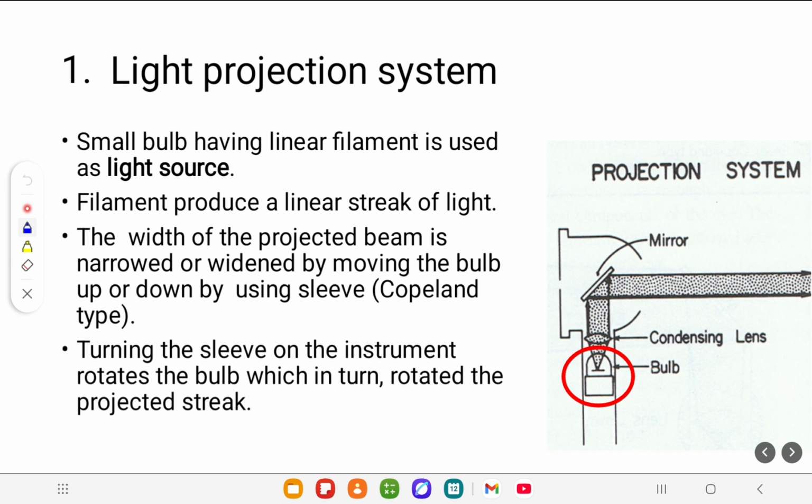That's just an effect. Yes, there is a plane mirror, but it's the plane mirror effect and the concave mirror effect. It's an effect, and the effect mainly depends upon the distance between the bulb and the condensing lens. That's crucial. That's crucial. From an optical point of view, I'll tell you later when it comes.